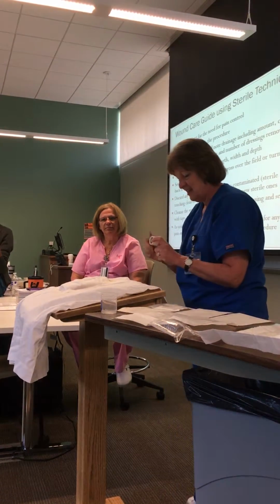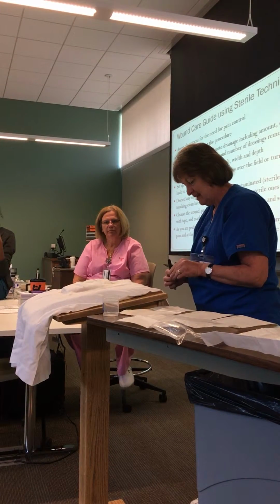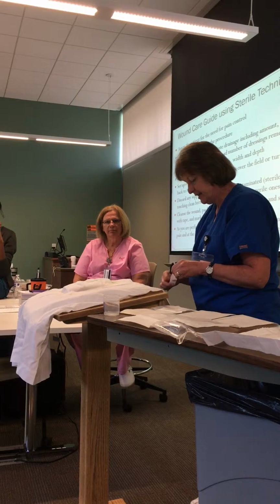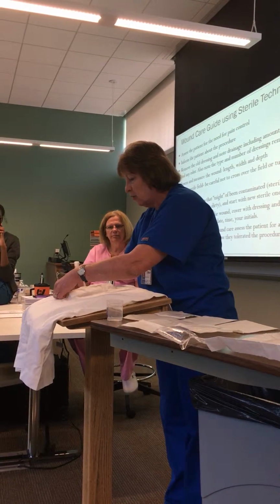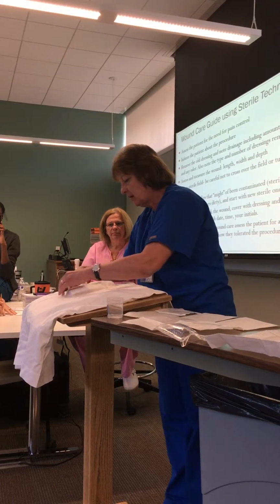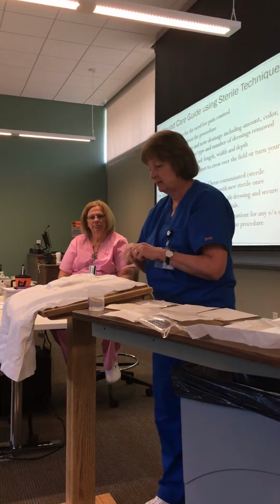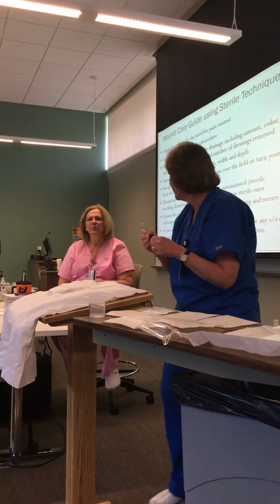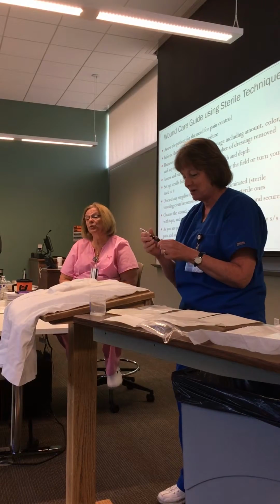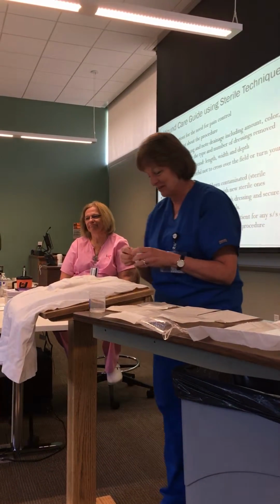Okay. And then I'll place that on there in the corner in case the wound drains and it gets saturated. You can still read what that is. Okay. What I don't want to see you guys doing is going like this and writing on your patient. Hold still, Mrs. Smith, I'm going to write on you with my Sharpie. It's just rude, yeah. It's just rude. You'll see people do it too.